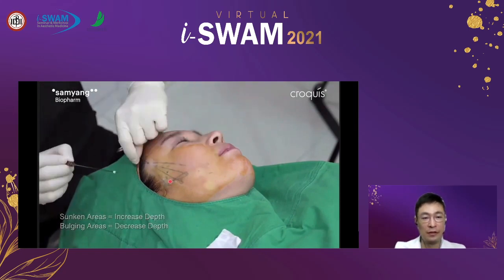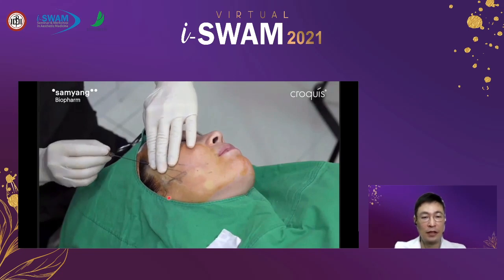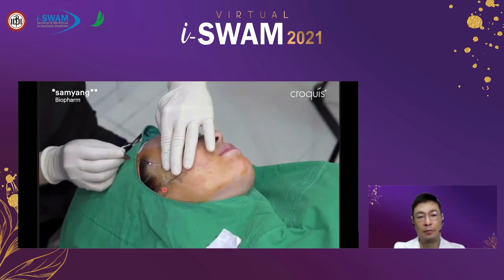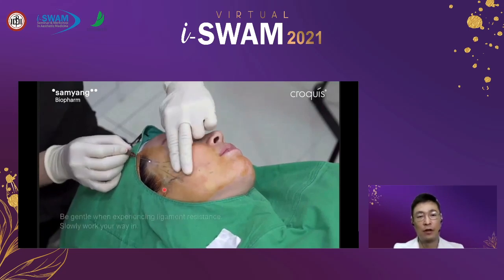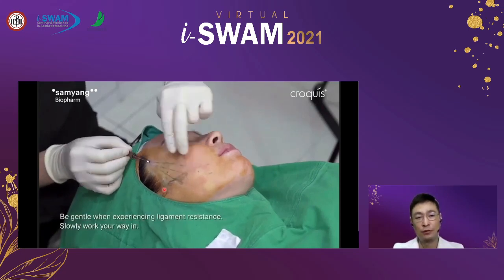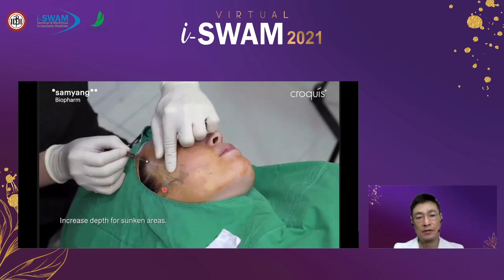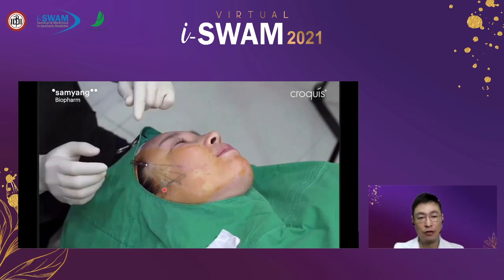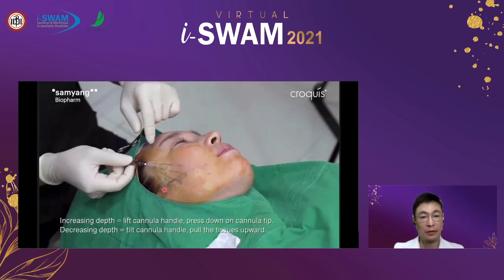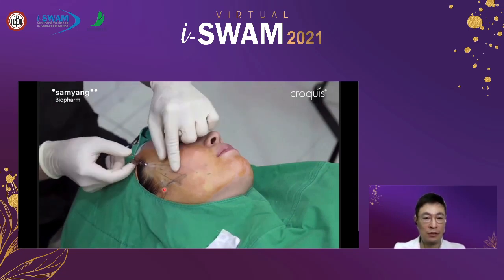So to prevent sinking of the lateral cheek, you may keep your cannula parallel to the skin surface. Where the skin is bulged, you advance a little shallower, and where there is a sunken area, you should advance the cannula a little bit deeper. But do not penetrate or touch the SMAS.